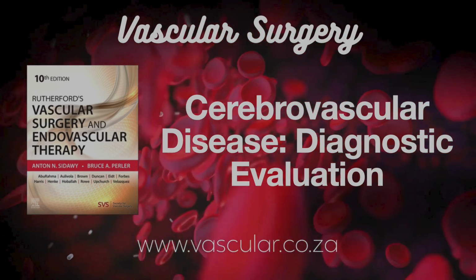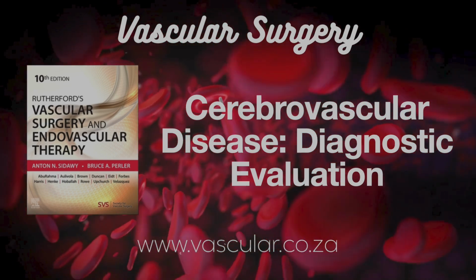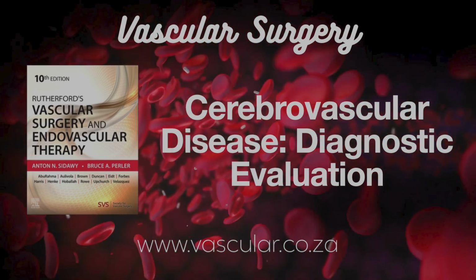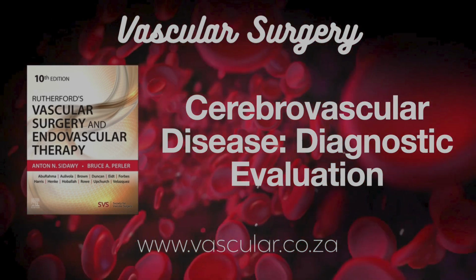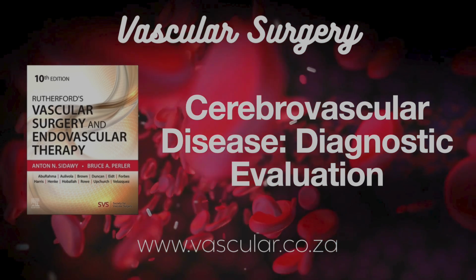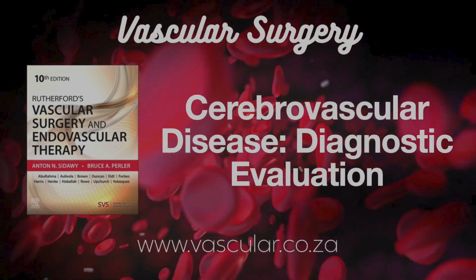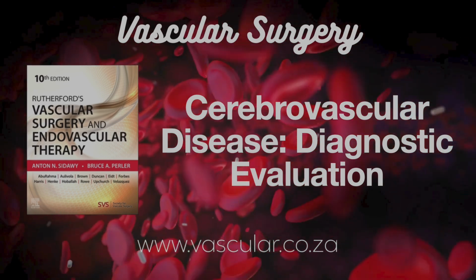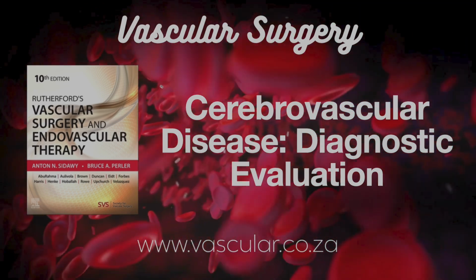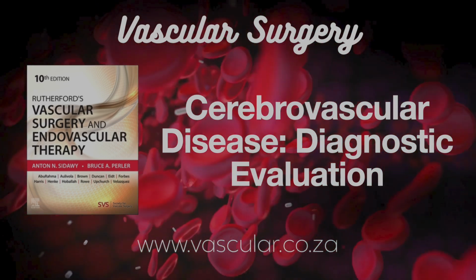Okay. And the downsides of CE-MRA for carotid evaluation? Well, it doesn't show the surrounding soft tissues as clearly as CT does, unless you add specific MRI sequences. Also, that calcium in the plaque, MRA doesn't define it nearly as well as CT. It can sometimes make calcium look like narrowing, leading to an overestimation of the stenosis. So it might make things look worse than they are if there's lots of calcium.